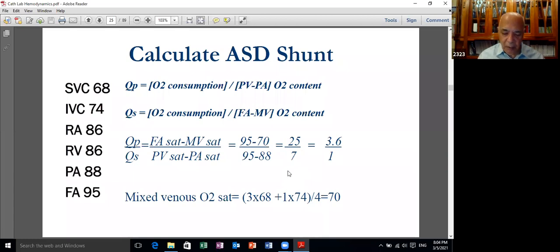Obviously, everyone is asking what's the role of cardiac catheterization in congenital heart disease. There is still a huge role of cardiac catheterization in congenital heart disease. Any intervention will include cardiac catheterization. In patients in whom you want to measure the pulmonary vascular resistance, you have to have cardiac catheterization. In patients who need a cardiac biopsy because of cardiomyopathy and myocarditis, you need cardiac catheterization. And in patients in whom the resolving power of the non-invasive studies, like imaging of MAPCAs, major aortopulmonary collaterals, is insufficient, you need cardiac catheterization, and so there is still a role of cardiac catheterization.